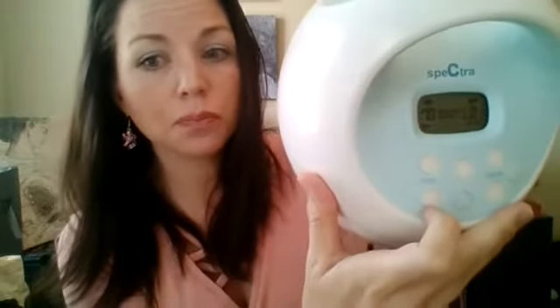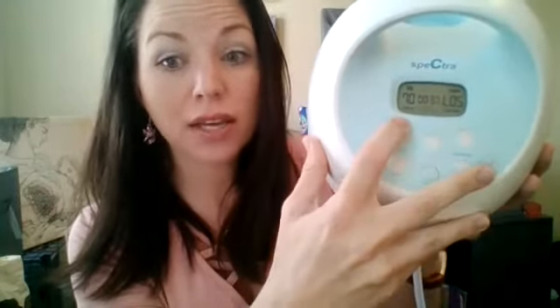Now let's look at what vacuum means. You turn the power on, press the wave button, and you're in massage mode or letdown mode. Over here is the vacuum — it can go up and down — and it will go from one to five in massage mode. Cycles is how fast, vacuum is how strong.